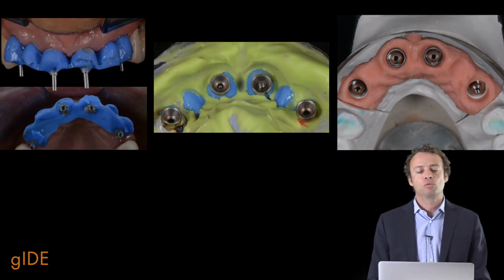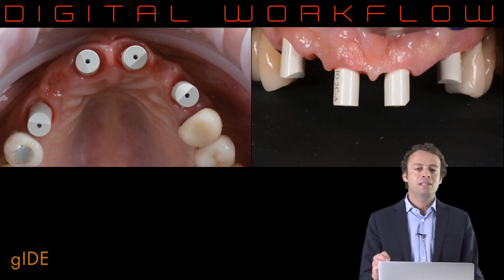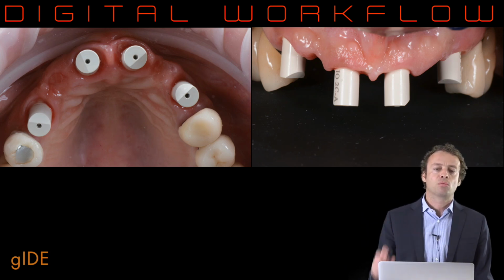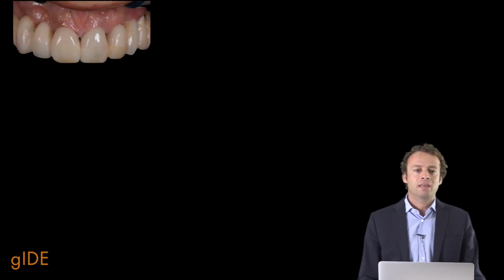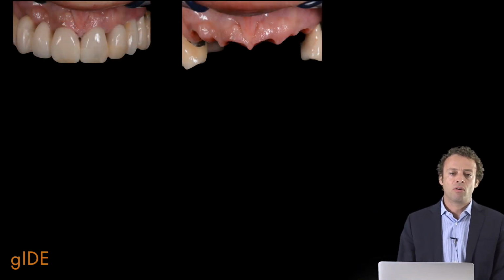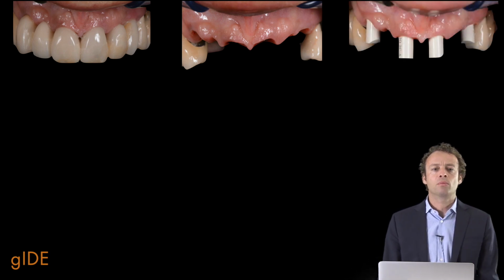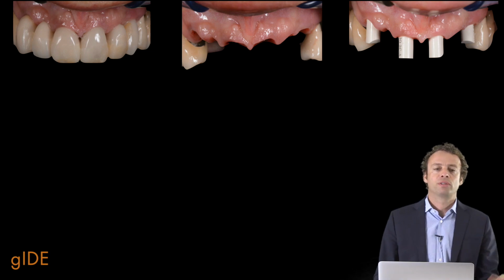And in this kind of situation where we have residual teeth in the mouth, the idea to manage this kind of clinical situation with a digital workflow is really strategic, because we can work taking 3 different intraoral impressions with the intraoral scan in order to be able to copy the volume and the morphology of the temporary.